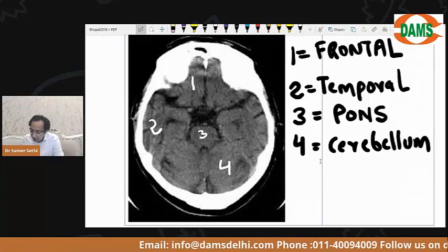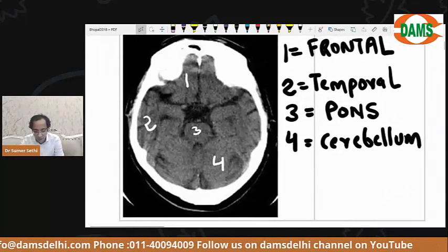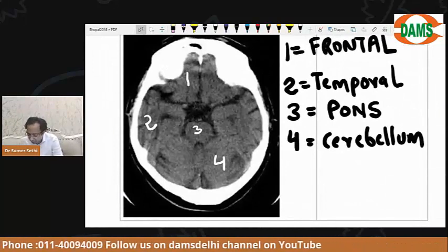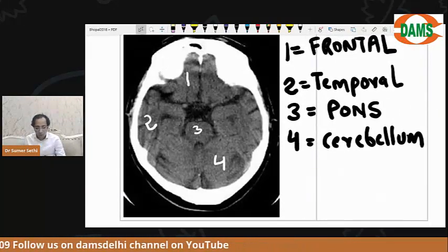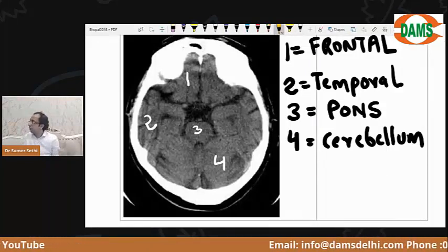Okay, beta. A parietal, I will tell you, bache. Wait. It doesn't work like this, beta, anatomy. You have to wait and give me time. I'll explain every lobe to you. Understand? Okay. Now, once you're clear with this, everybody, I want you to see.